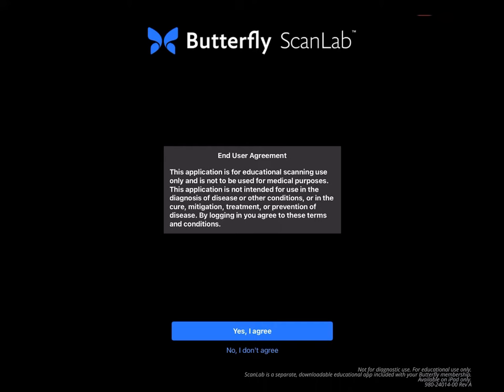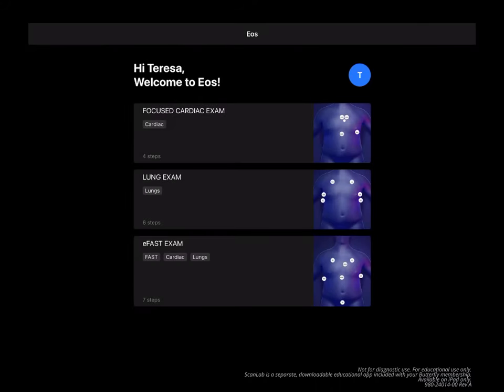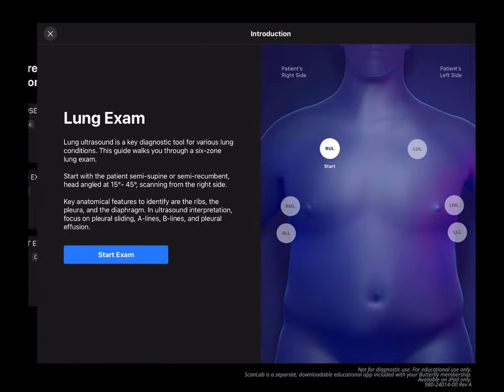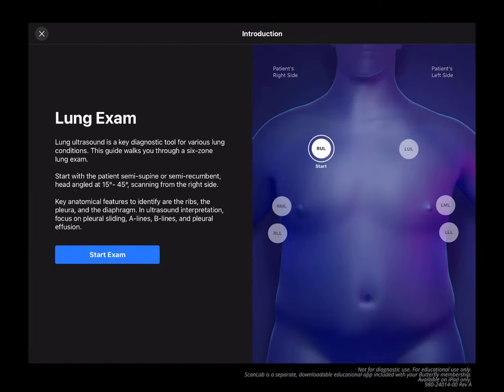The mobile device will need to remain in landscape mode. Select the exam type you'd like to practice from the home screen — I'm choosing Lung Exam — then click Start Exam.